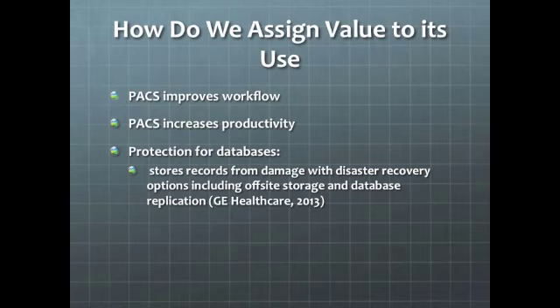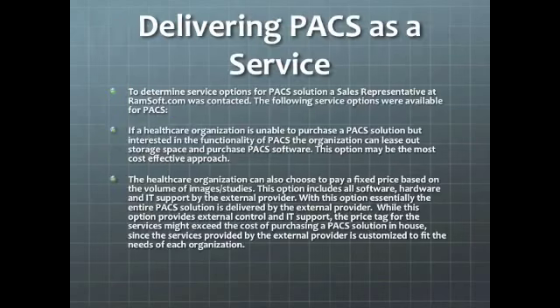There are many ways we can assign value to PACS. PACS improves workflow among healthcare professionals by providing vital information for professionals to share data and consult with one another on patients' care to make more accurate treatment suggestions. PACS increases productivity within departments with mobile access to images and reports on electronic devices such as Apple or Android. There is also protection for databases, which store records, from damage with disaster recovery options, including off-site storage and database replication.